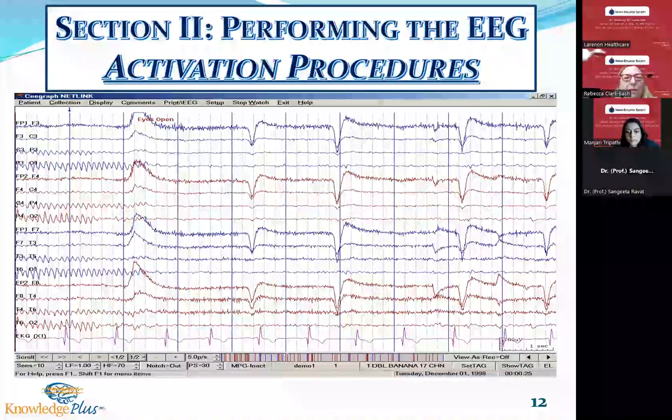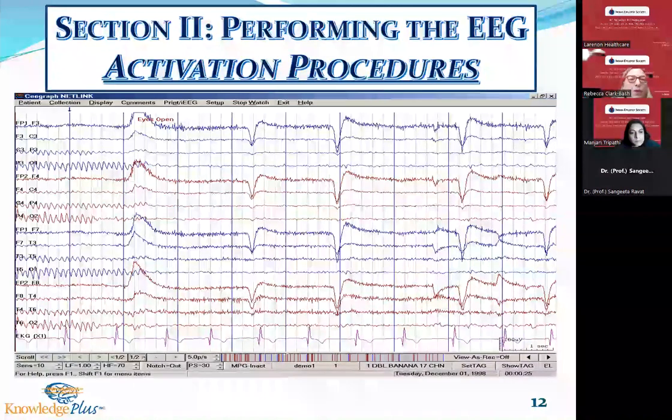Now, the frontal leads, FP1 and FP2, are in the first channel, the fifth channel. You can see all of those big excursions. That's eye opening. And this patient has beautiful PDR, beautiful posterior dominant rhythm. And if we look over here in the second, you have P3 to O1, beautiful. And then on the right side, there's a little waning. That's not significant as long as it's not persistent. But anyway, we have beautiful posterior dominant rhythm. The patient opens their eyes and they have bilateral blocking. We don't see it on the screen, but when they close their eyes, that beautiful PDR comes back. And that is normal, expected.